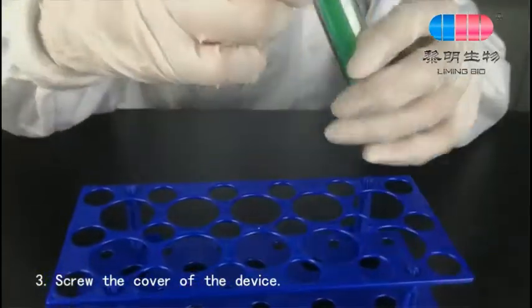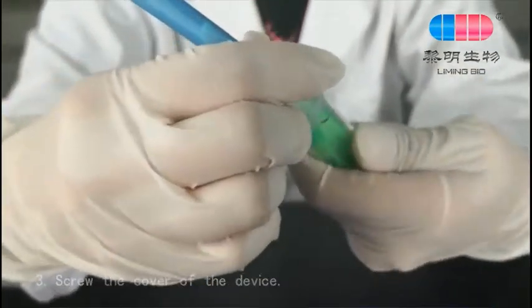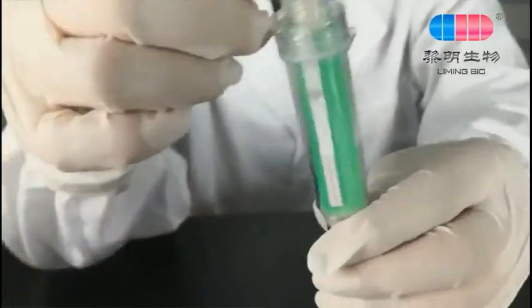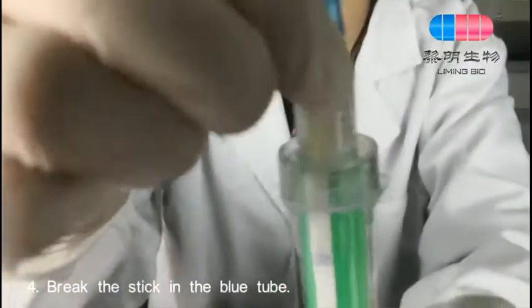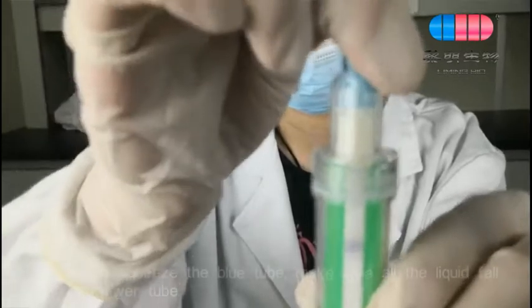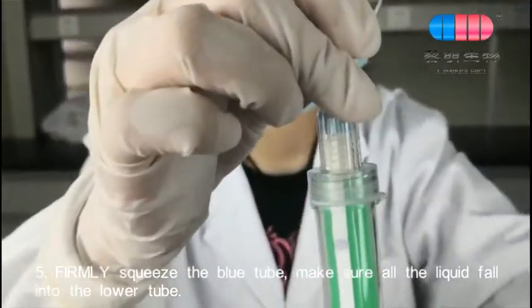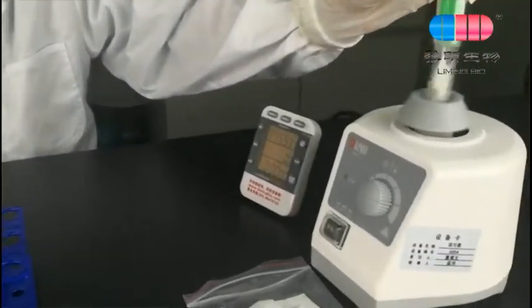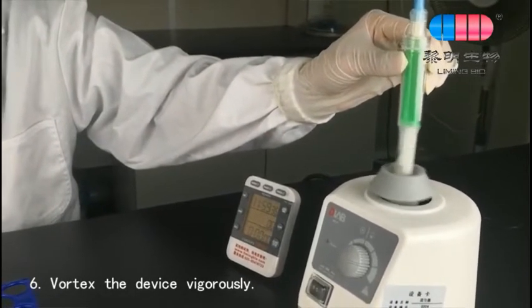Screw the cover of the device. Break the stick in the blue tube. Firmly squeeze the blue tube, making sure all the liquid falls into the lower tube. Vortex the device vigorously.